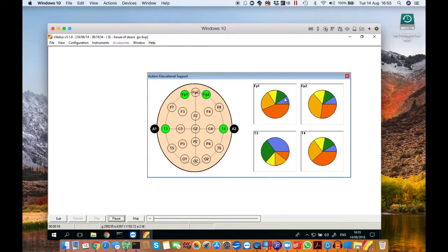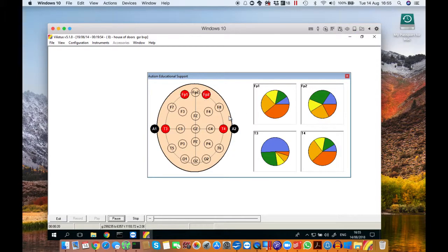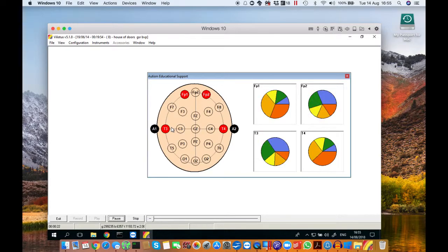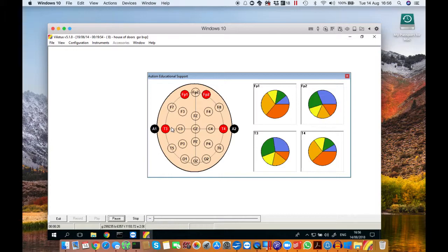On the right-hand side you'll see four pie charts representing the data coming from those electrodes. The different colors mean different brain frequencies. We'll place a key below so that you know which one is which.